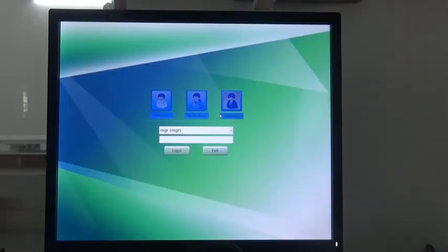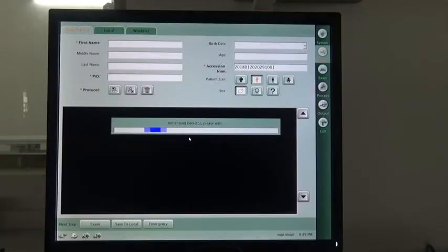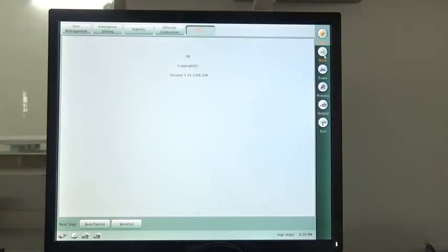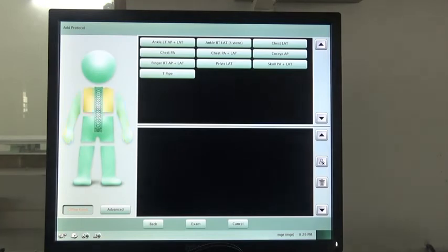Next, I will show you the software of this system. When you enter the system, you will see this page. Here is where the engineer can adjust the software parameters. And here you can input the patient number, patient code, choose the body size, and select the sex. When all is finished, press here and you will see the next page.